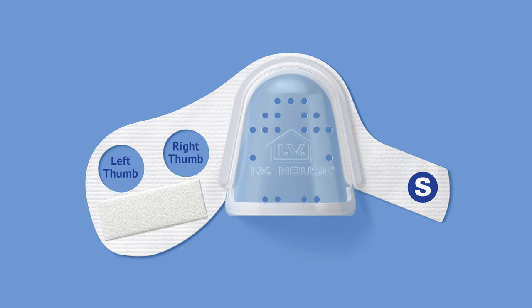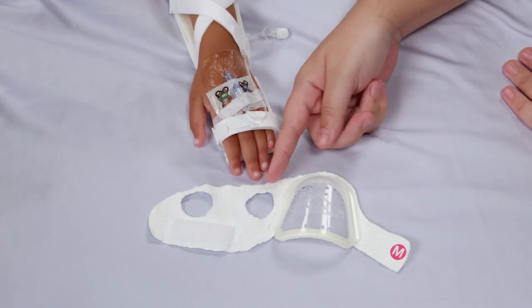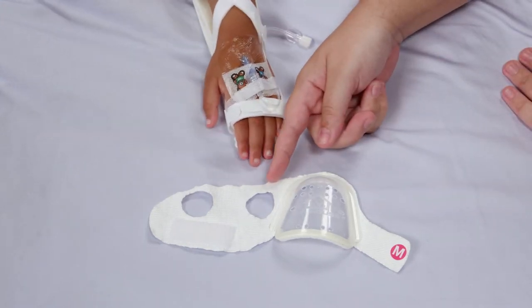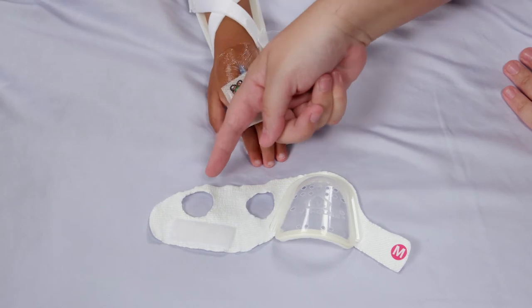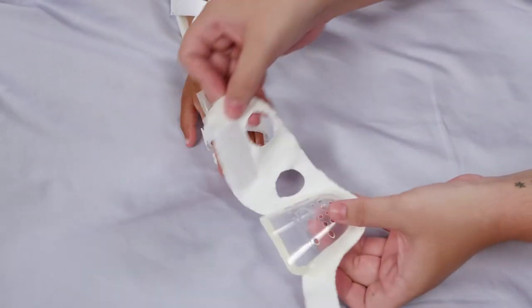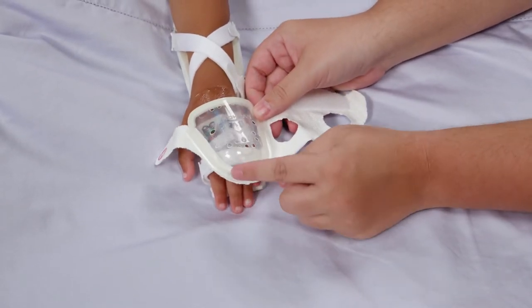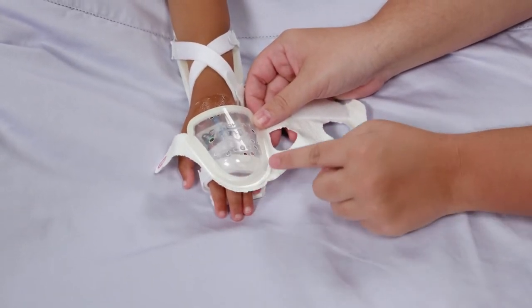It's the placement of the thumb that determines a left or right-hand fit. Refer to your product directions for further details. On the right hand, slip the thumb through the thumb hole closest to the dome. On the left hand, slip the thumb through the thumb hole farthest from the dome. Position the clear, ventilated plastic dome over the looped tubing and catheter hub, with the round edge of the dome pointing toward the fingertips.